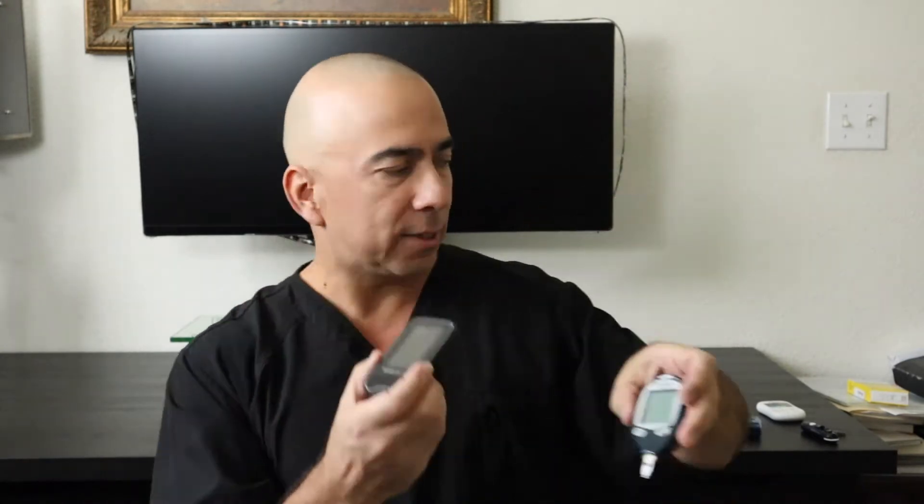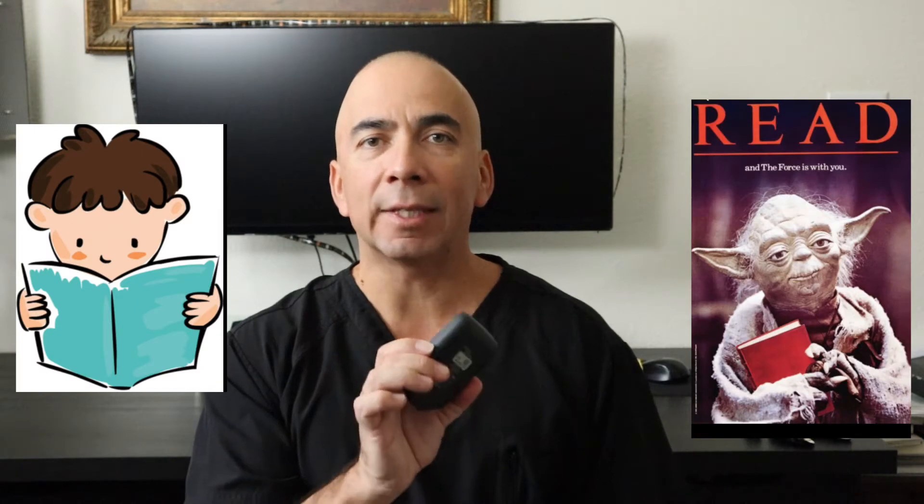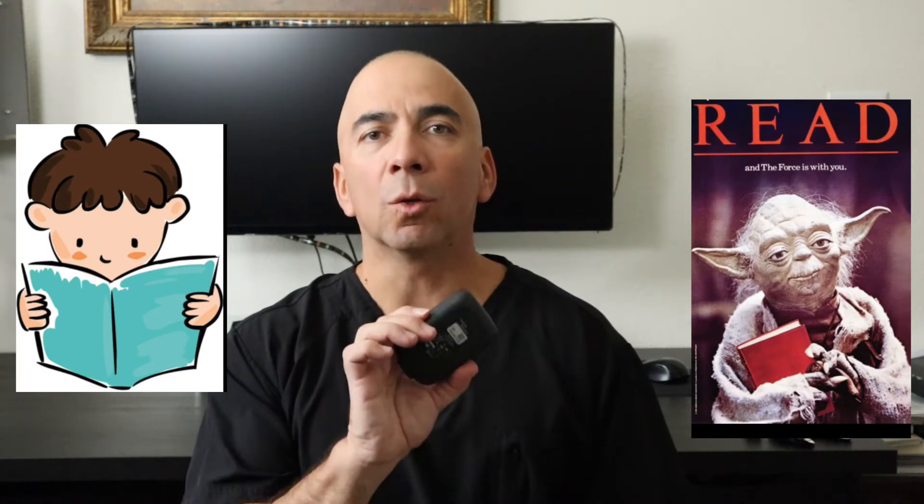Well, that's what a continuous glucose monitoring system does. This is a Freestyle Libre, and this is the reader. It kind of looks like the glucometer, but the difference is this one you have to poke your finger, and this one you don't. It has an area for a test strip if needed, but this is a reader and it does exactly what that says — it reads your blood sugar.